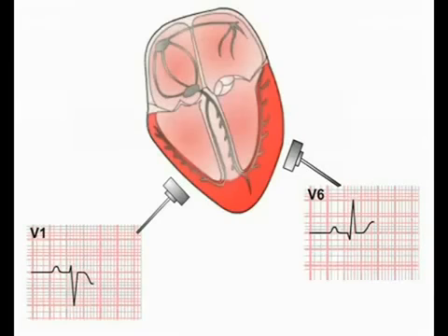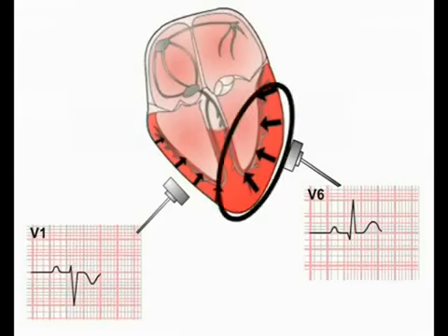We've already seen that repolarization spreads through the ventricles in the opposite direction to the depolarization wave, beginning in the epicardium and spreading from the epicardial to the endocardial surface of the ventricles. The deflection produced on an ECG by ventricular repolarization is again dominated by the signal from the left ventricle. As this repolarizing current is moving towards V1, the deflection produced is negative in this lead. In contrast, this repolarizing signal is moving away from lead V6, producing a positive deflection.